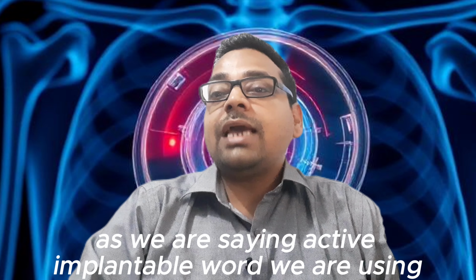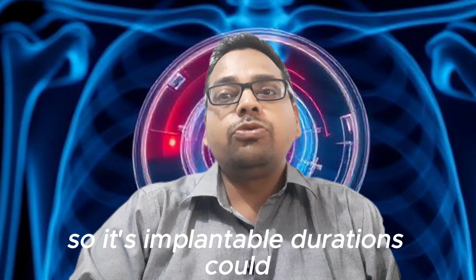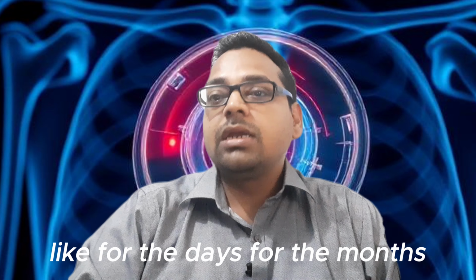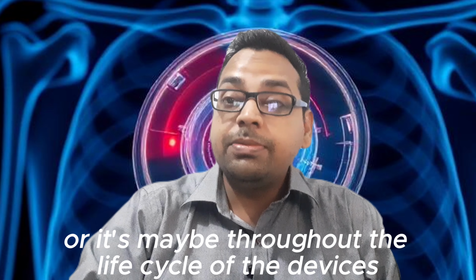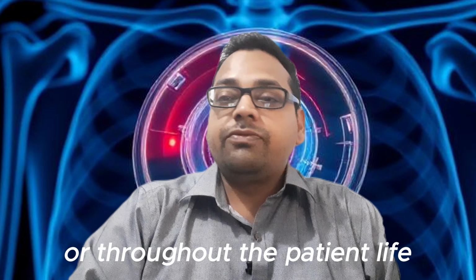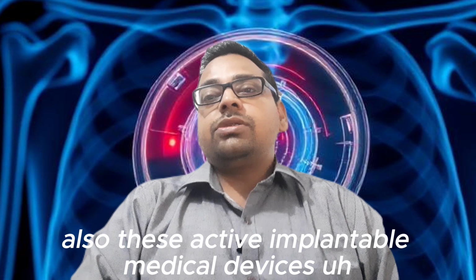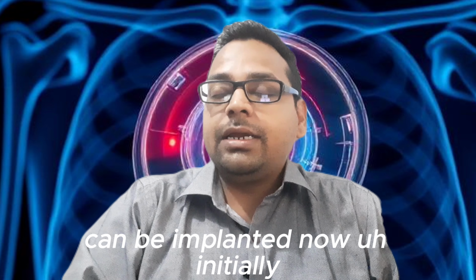Now, as we are saying "implantable," the implantation duration could be for a while, like for days, for months, or it may be throughout the life cycle of the device, throughout the patient's life. In that form also, these active implantable medical devices can be implanted.